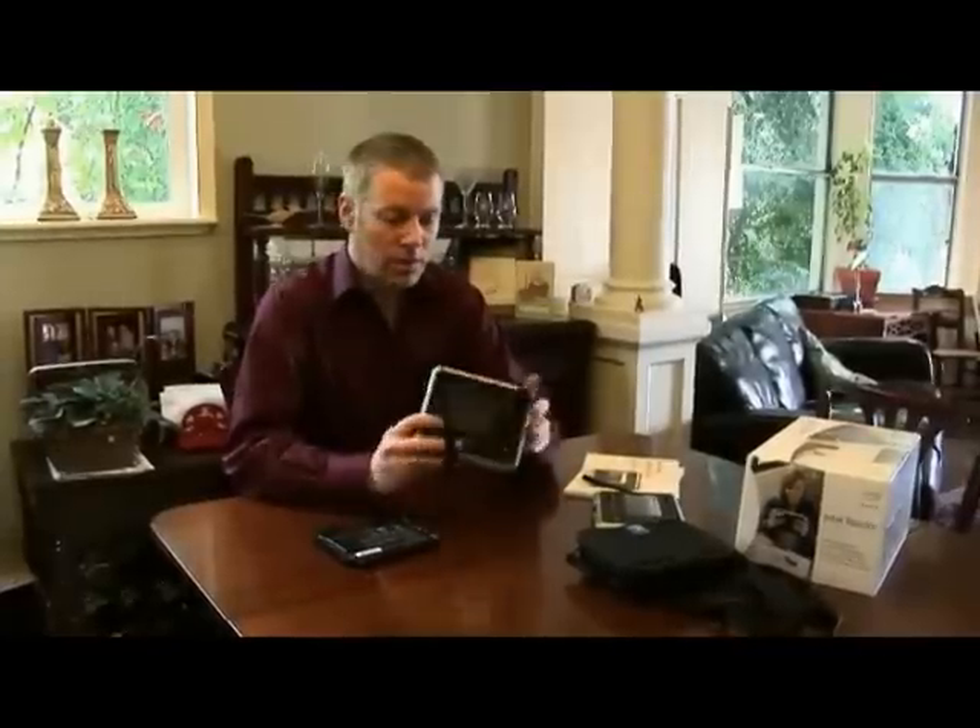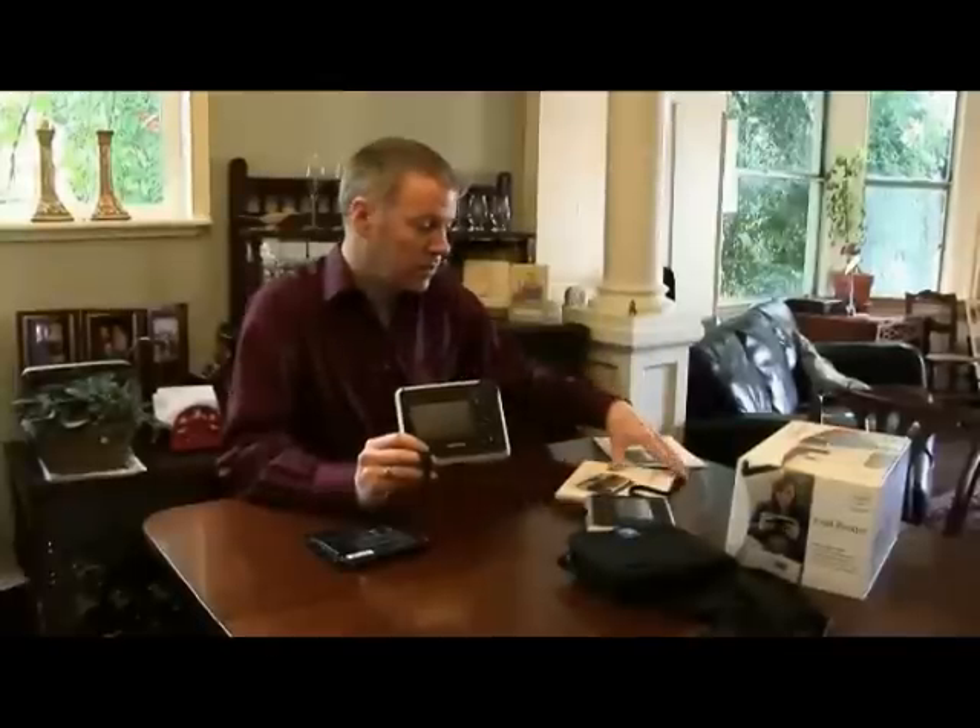Hi, my name is Ben Foss and my title is Director of Access Technology here at the Intel Digital Health Group. Today we're going to be showing you the Intel Reader. We're going to be walking through some basic usages, information that you can find in the Quick Start Guide for the most part, as well as some more advanced usages which are in the Reader Manual.